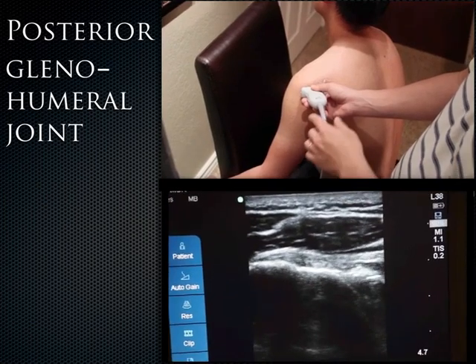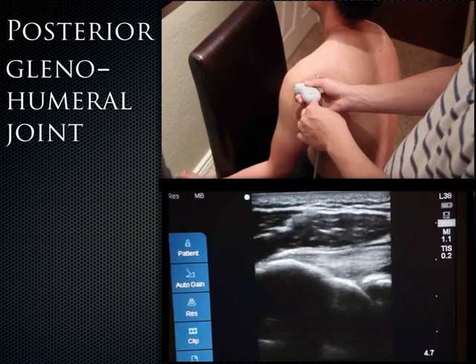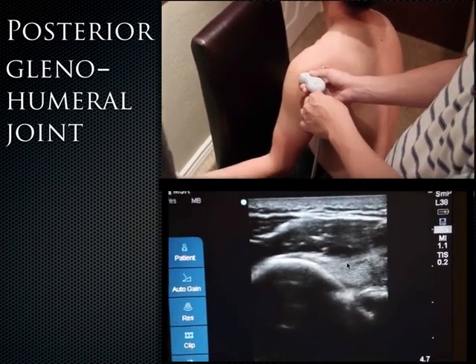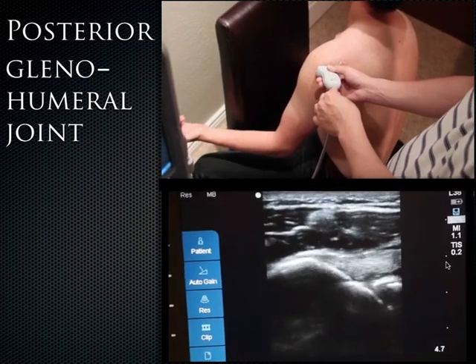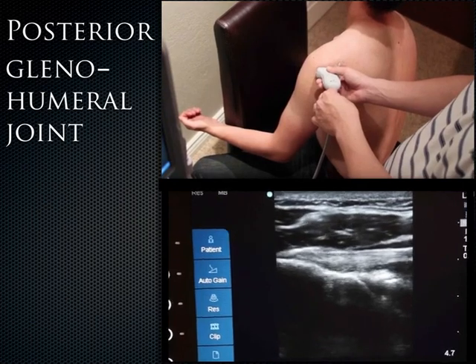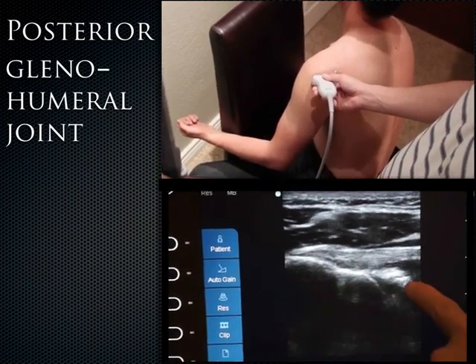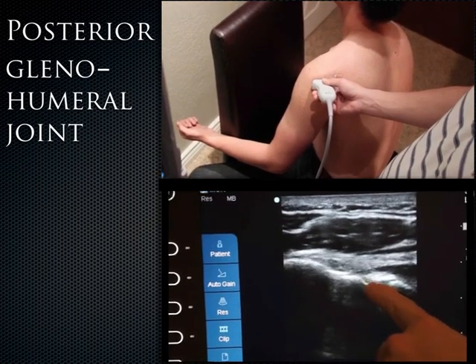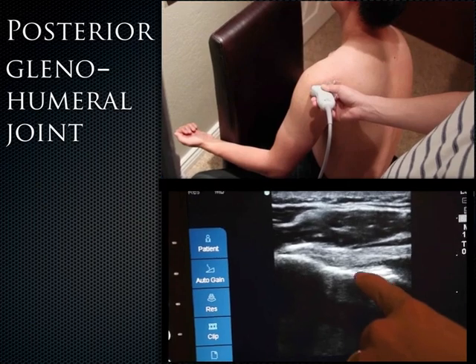And in order to demonstrate that, I'm going to have the patient externally rotate, and you can see that the infraspinatus is actually contracting, and then have the patient go back into neutral. And you can see that infraspinatus is moving right there. Deep to the infraspinatus, you have the humeral head and the glenoid right here. And right here, this hyperechoic structure, which sometimes appears triangular, is the actual posterior labrum.